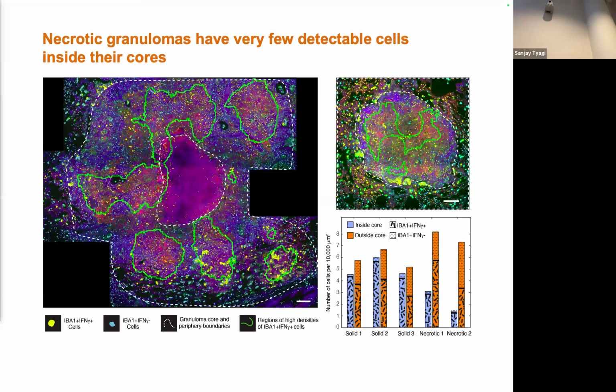It probably began in the core of the center, where the region which is acellular, and the bacteria was contained for a while, but then the secondary granulomas begin to form that look like fresh new granulomas. They have the same features. So this is quite often found in human disease, that there are these secondary granulomas around the primary one.